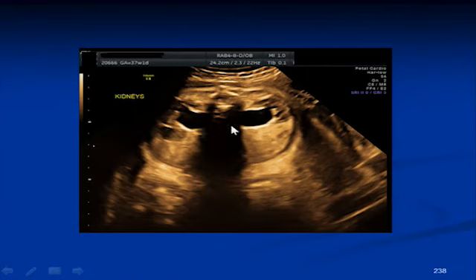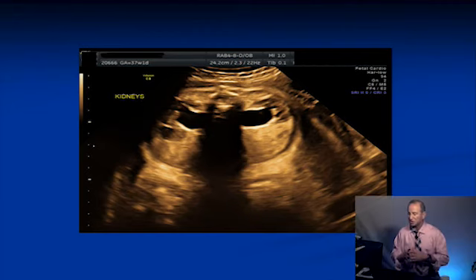So these are the kidneys. And there was a study called the RADIUS study back in the mid-90s that showed that bilateral fetal pyelectasis can have a 3% association with Down syndrome. We don't think it is that high if it is isolated, but that's what the study showed. So if somebody comes with dilated kidneys, what are the chances that my baby has Down syndrome? I haven't done a blood workup for Down syndrome. There is nothing else wrong with the baby. I'll say 3% or less.